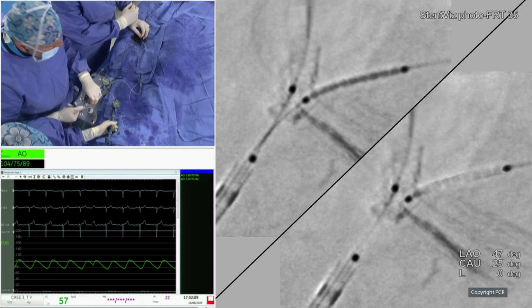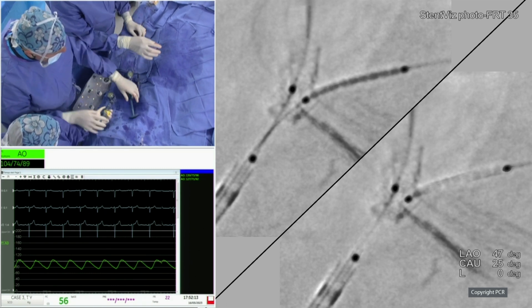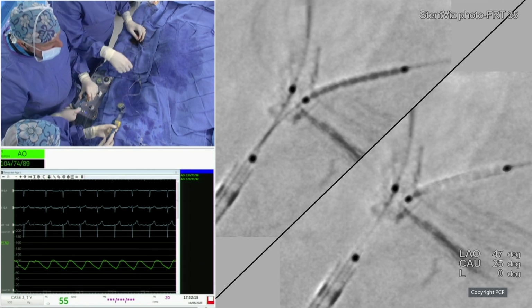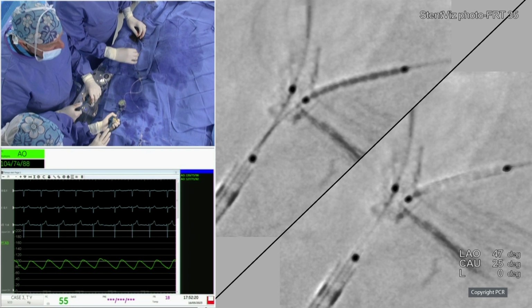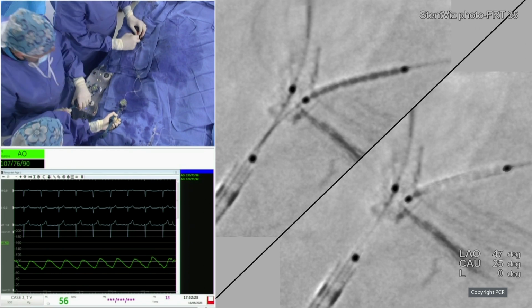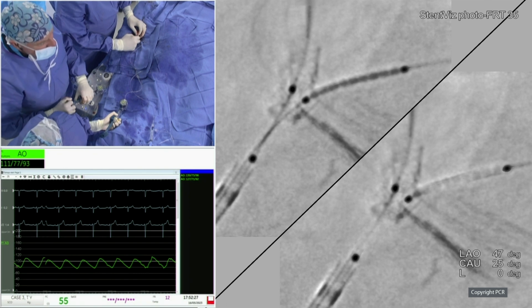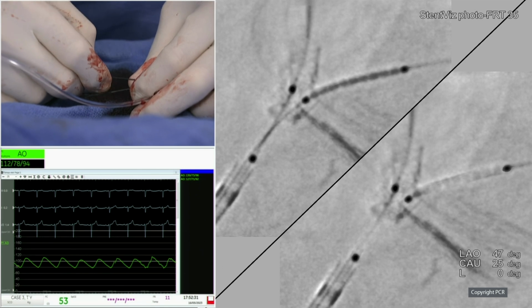Yeah, it's like a TAP technique. So the way we look here, the marker of the stent and the position of the stent, I would call that TAP. Do you agree? Minimal TAP, or a micro TAP? Or a major TAP? I mean, that's the question. Only the result will tell us how far.